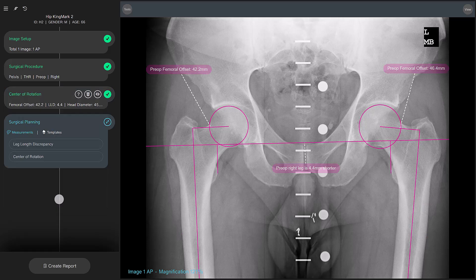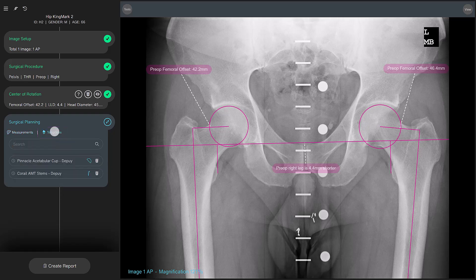Next, you can start adding templates. Select the templates tab to see a list of previously used implants. If you want to look for a different implant, type in the search bar and see the search results directly below.